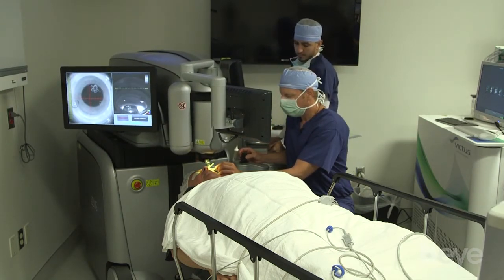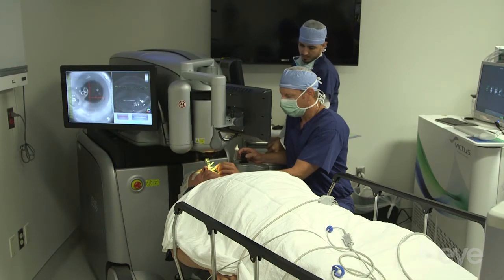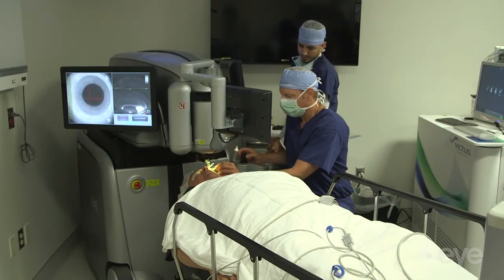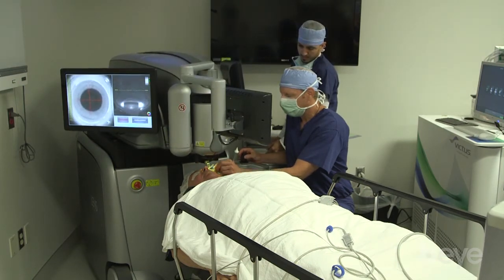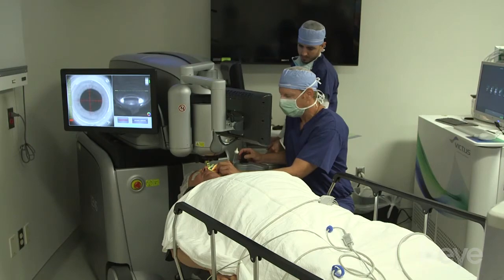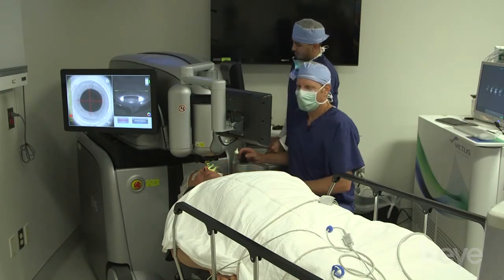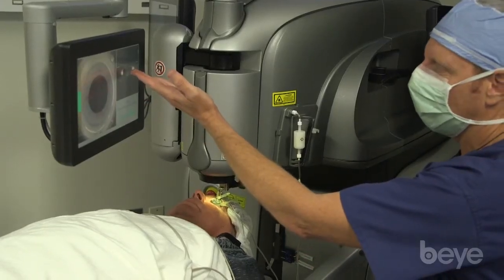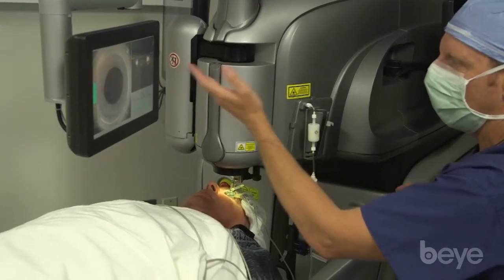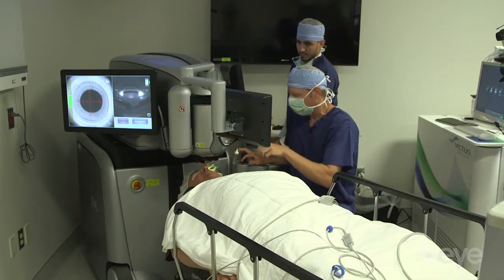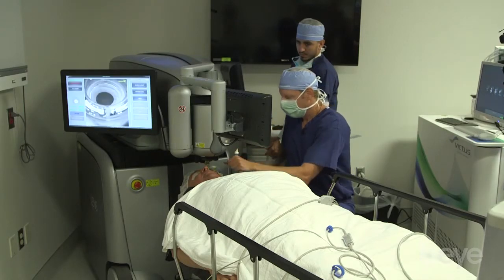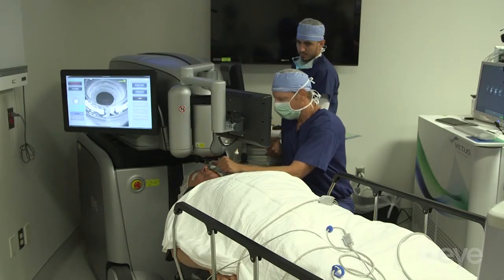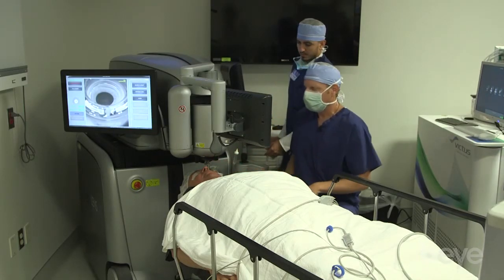If there's a little bubble, we'll just lift up a little bit and then come back down. Then we'll make sure these two interlock like so. Bring this up until the yellow line is right at the apex of the cornea. Hold real still, and then we'll just use this to lock the two pieces together.